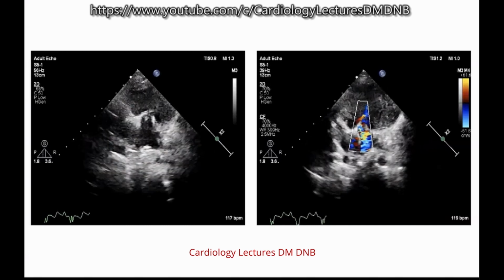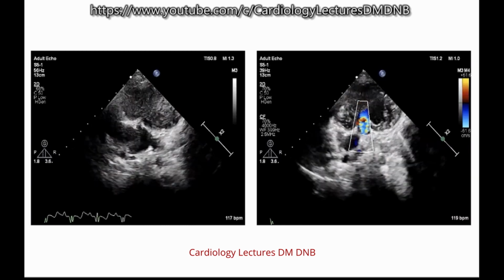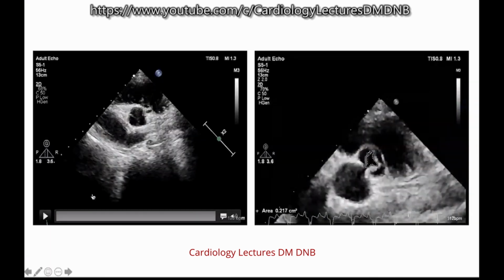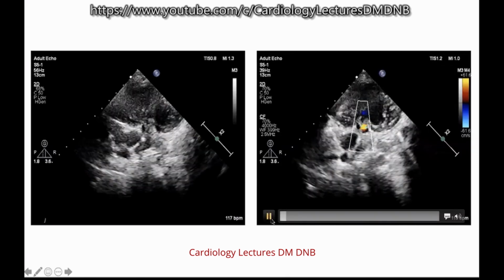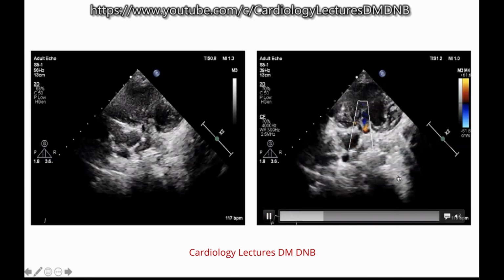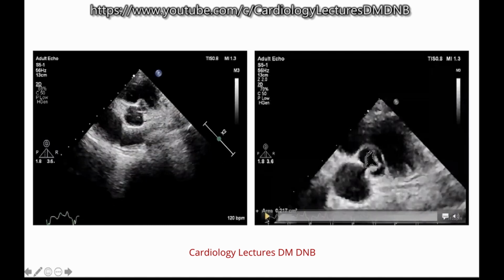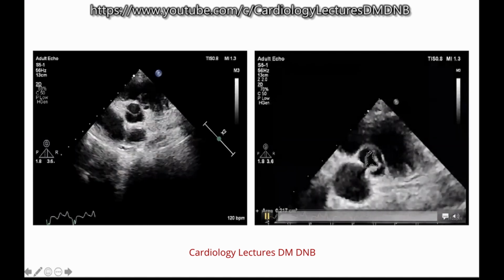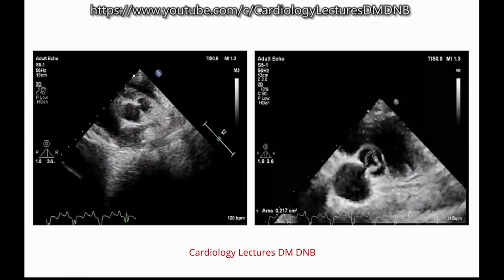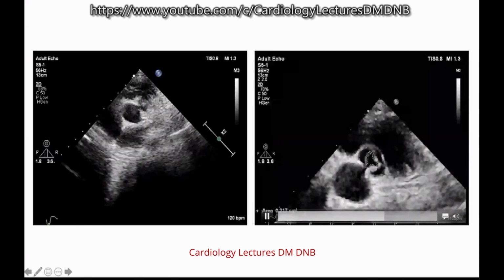Is the valve dysplastic? Or do you want to see more views of the valve? I want to see more, because there is post-stenotic dilatation. Is there a significant post-stenotic dilatation? I think the valve is doming and it is not dysplastic. This is what appears to me. Okay. Maybe Dr. Anune would have seen it better.